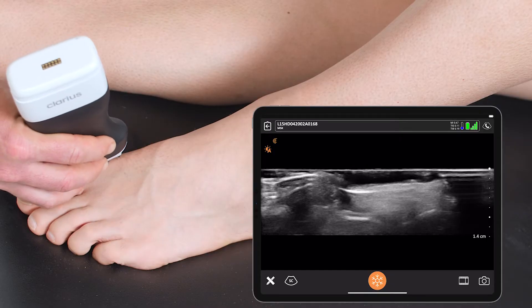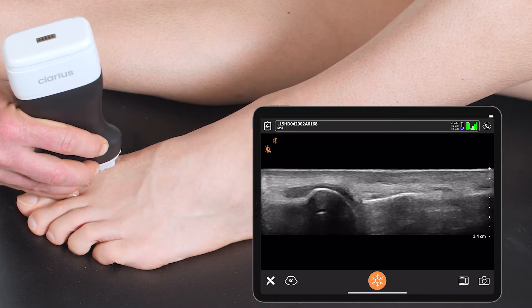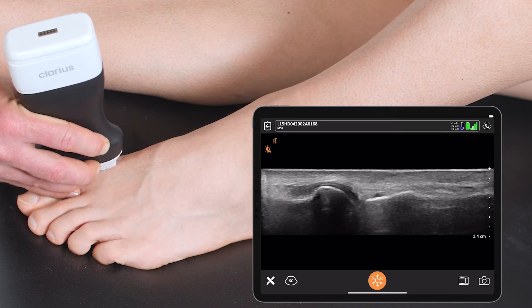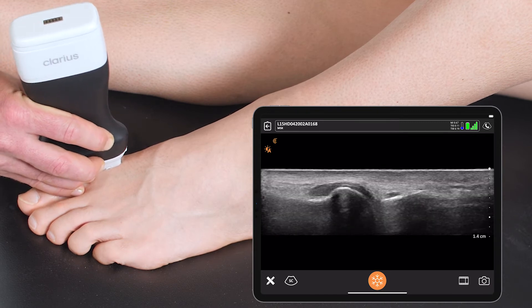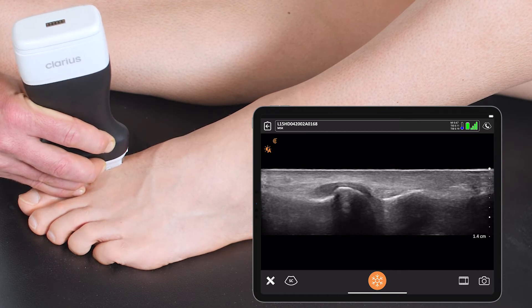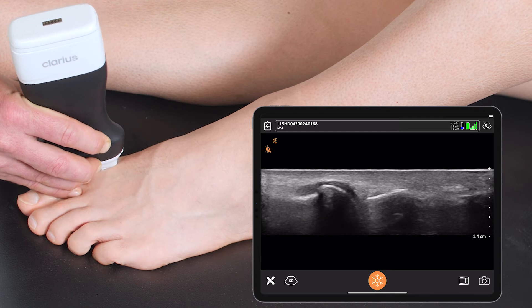I'll place the transducer right over the joint space, here identifying the edge of the bony cortex of his metatarsal and the phalanx. I can identify the cartilage here around the head of the metatarsal, and I would see a joint effusion as black fluid coming between the two bones, which I don't identify here.